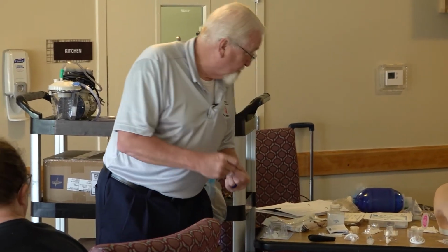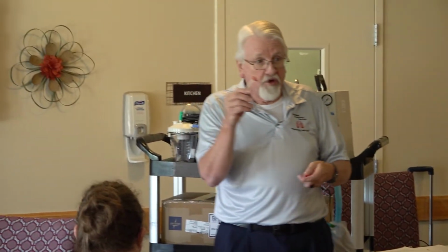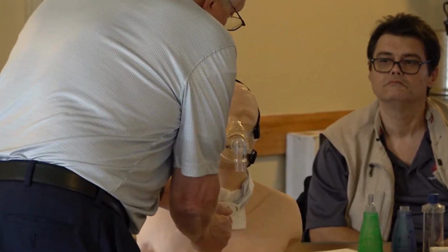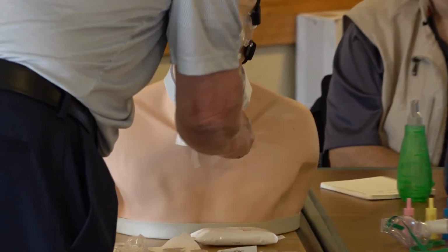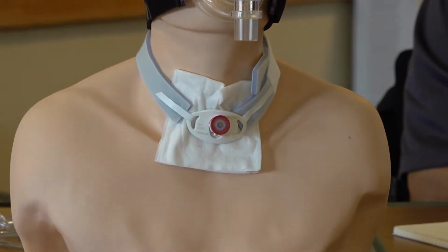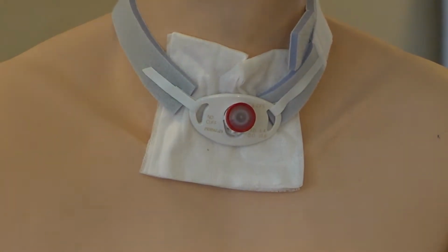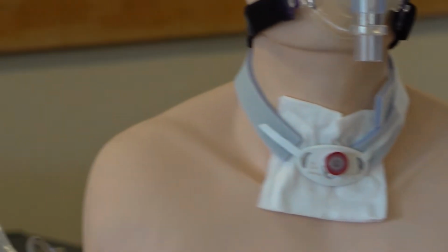Another thing about trachs is, this is a cap actually for the one Bob has in. His is red. This is for a regular Shiley. Capped.